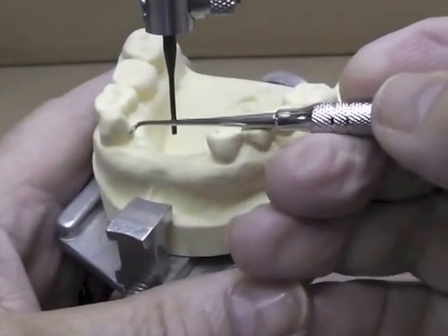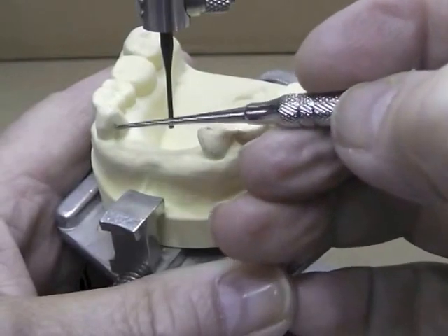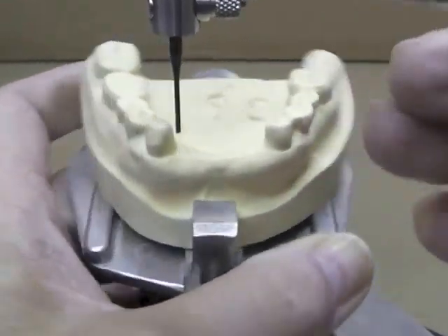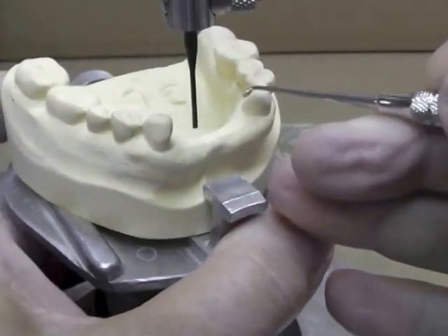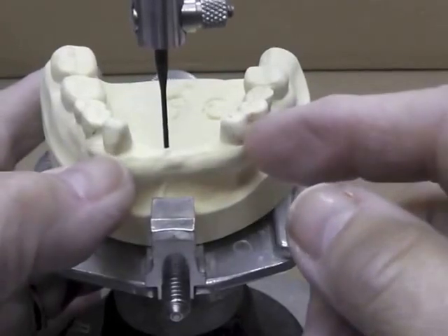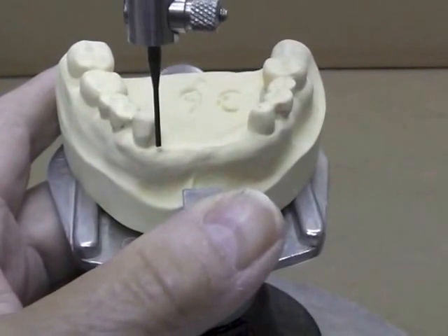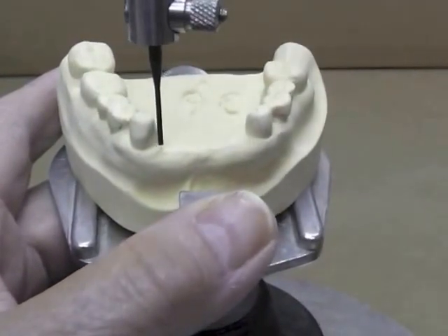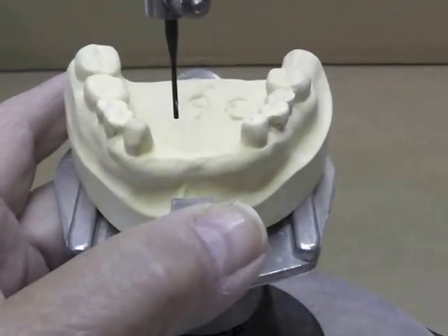Our guide plate is only going to come up to about just distal to the cusp tip on each side. We're not going to come far forward. If we had a real tilt on our teeth in that area and removed that area way out, we'd have to set a larger tooth in that area and the patient may not be happy with the size of tooth.